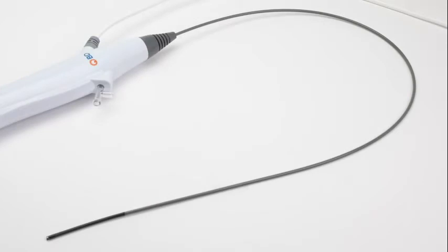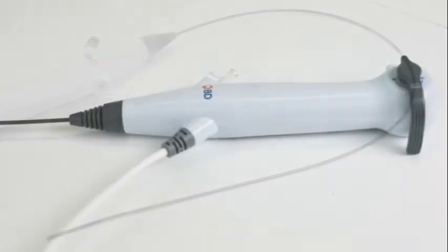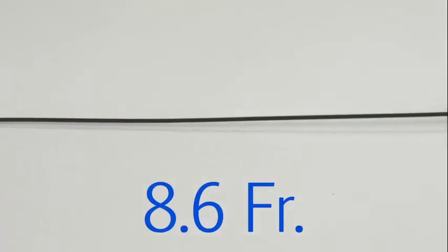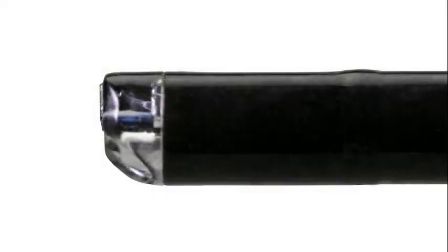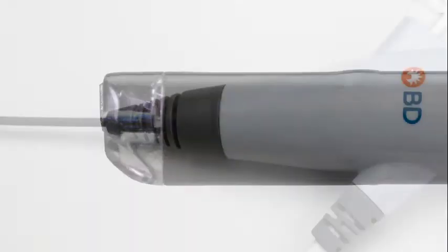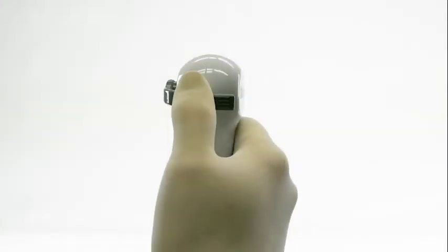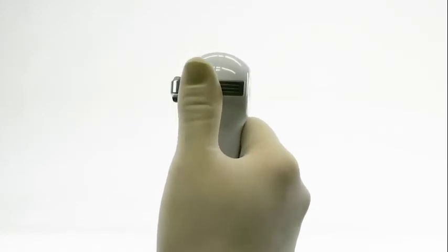The 3.6 French working channel enables the delivery of surgical devices and irrigation to the distal tip and surgical field. Starting from the handle and running up to the distal section, the insertion tube is 8.6 French. The distal section then widens to 9.5 French before narrowing to 7.4 French at the tip. The flexible insertion tube is connected to the handpiece, which includes the articulation lever that deflects the distal tip of the scope.